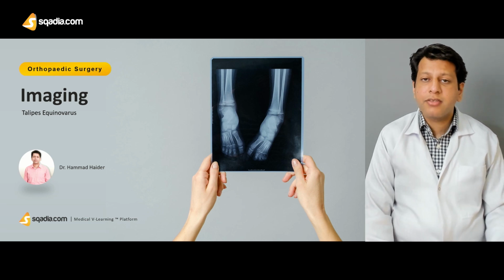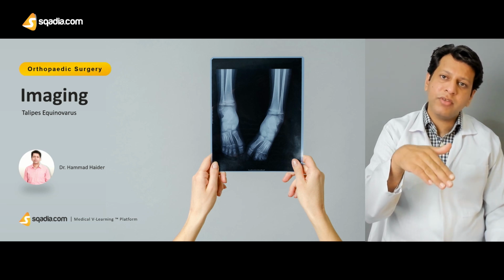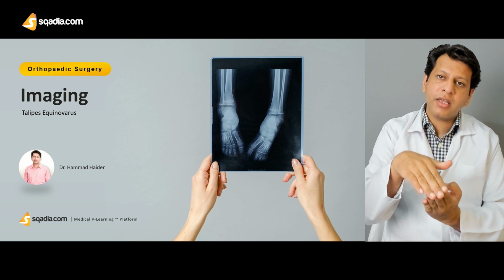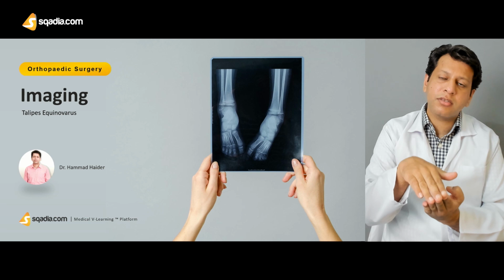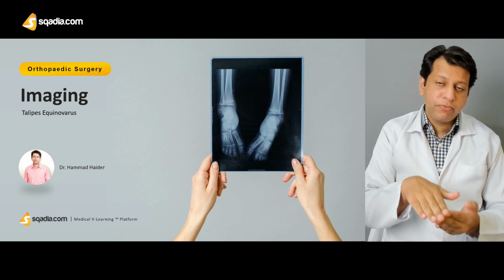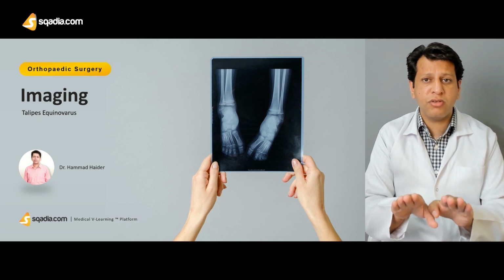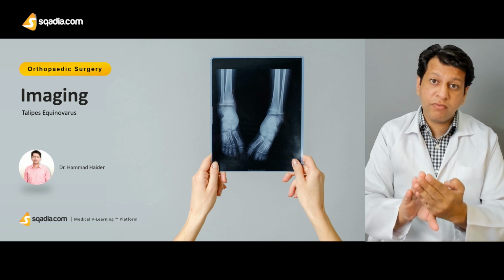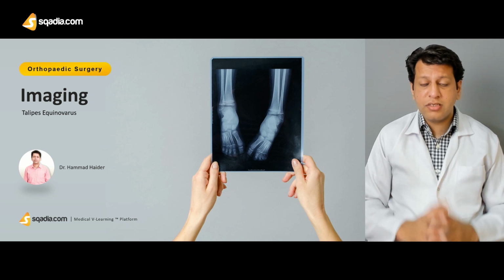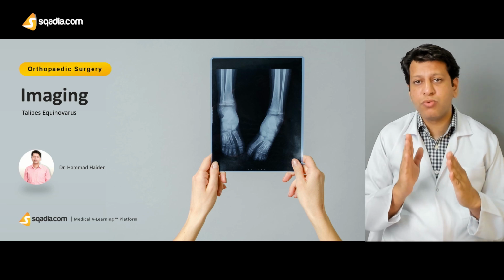And when we are getting the x-rays, as you know, the foot is actually in the plantar flexed position with slightly varus. So when you're taking the AP and the lateral views, we ask the radiographer to make it maximum dorsiflexed which is possible. If the foot is coming till neutral, he or she should get the x-rays done in the neutral. If the foot can be dorsiflexed, it should be dorsiflexed, and then the AP and the lateral views should be taken.